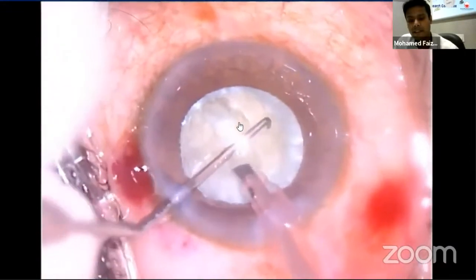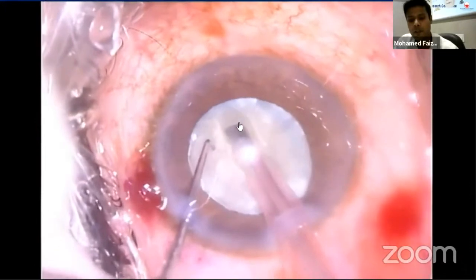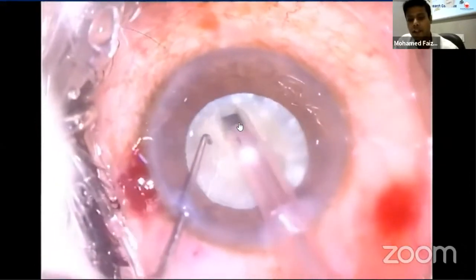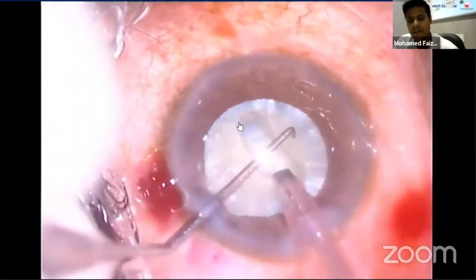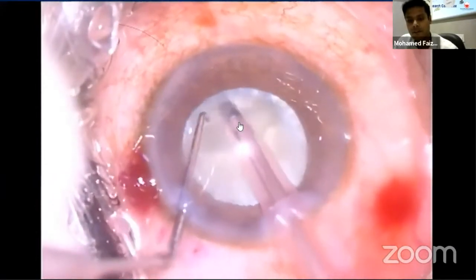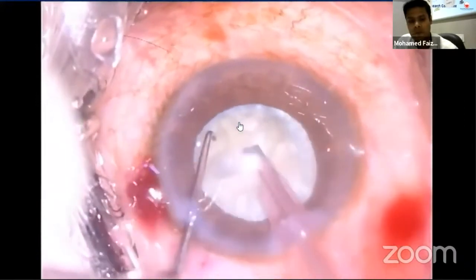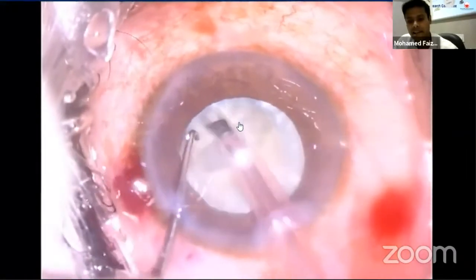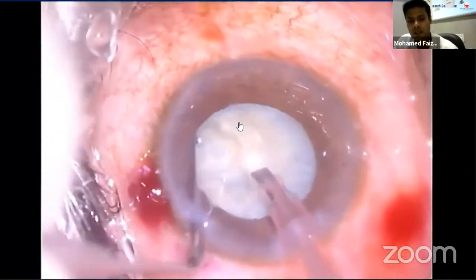On the distal side, the nucleus can be sculpted slightly further towards the periphery, but under the site of the entry wound the groove cannot extend as far peripherally due to the capsular ring and the angulation of the FACO tip. The nucleus is then rotated and the groove is extended. A second groove is made 90 degrees to the first groove. A clear reflex in comparison to the rest of the nucleus indicates satisfactory depth, after which you should not deepen further.